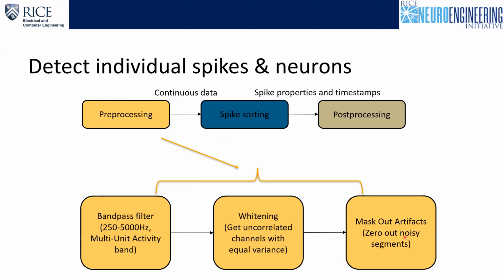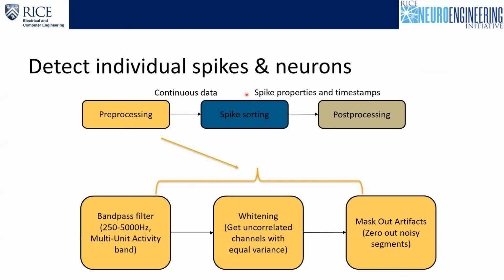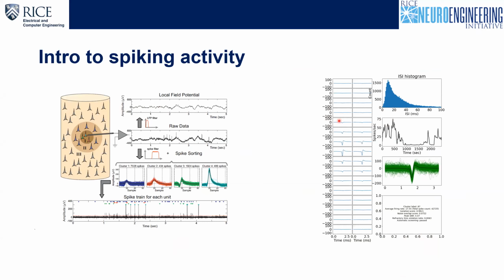And then we have some noise removal and artifact removal, like there are a lot of artifacts or noise in the electrical data as well. They have a very special characteristic. So we remove this, and then we do the spike sorting. So what I just mentioned over here, all of this, it's called spike sorting. So sorting spikes to different neurons or different cells. So this is spike sorting over here, and then we do some post processing that I'll explain in the next couple of slides.